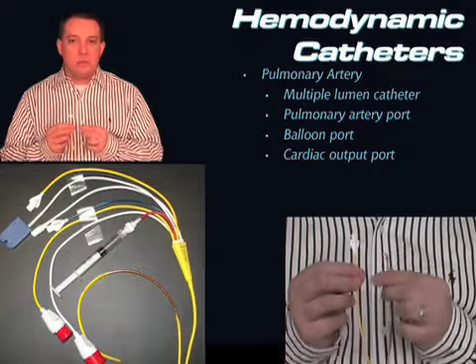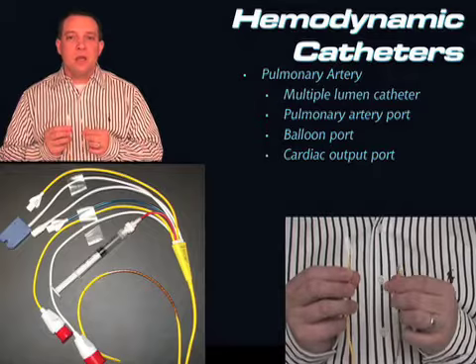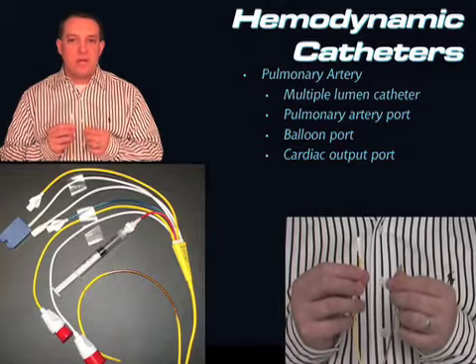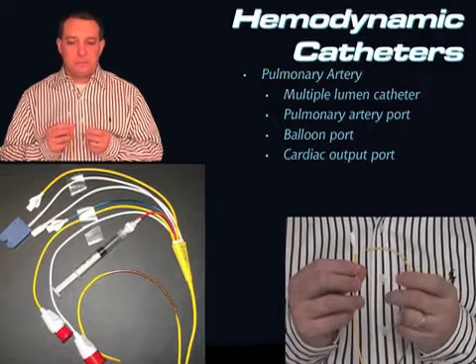I'll say that again because it's an important teaching point. The PA distal port exists for two reasons and two reasons only. We transduce it for pressure and we use it to draw SVO2 blood gases. We don't use it as an IV. We don't push fluids through it. We don't push drugs through it. We don't push blood through it. Any of that good stuff.